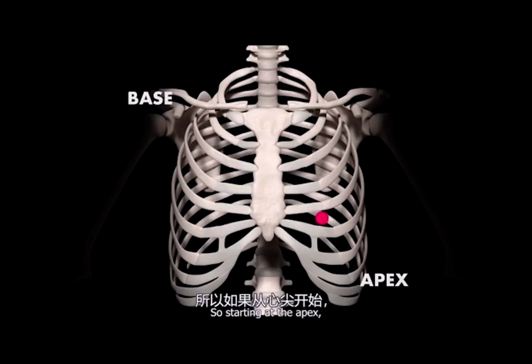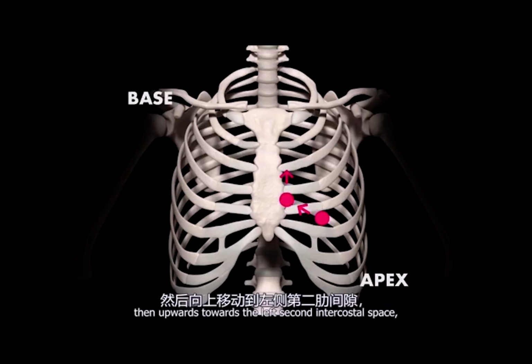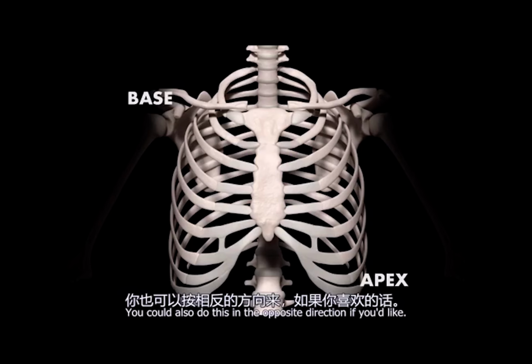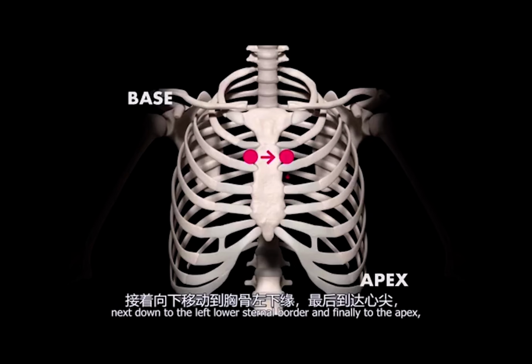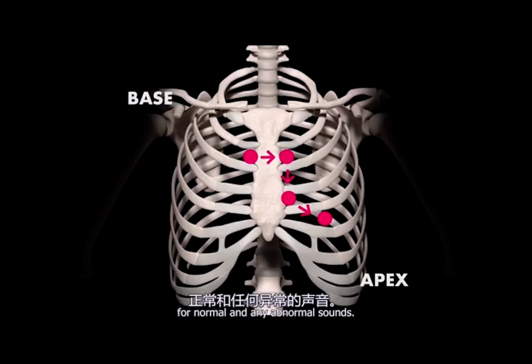So starting at the apex, you would move your stethoscope medially towards the left lower sternal border, then upwards towards the left second intercostal space, and then across to the right second intercostal space. You could also do this in the opposite direction if you'd like, starting at the right second intercostal space, then across to the left second intercostal space, next down to the left lower sternal border, and finally to the apex, while pausing and listening carefully at each auscultation point for normal and any abnormal sounds.